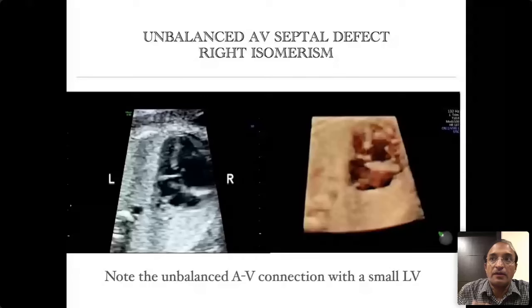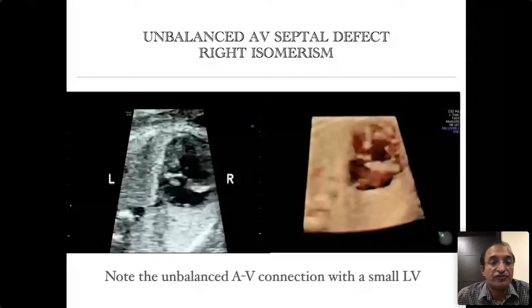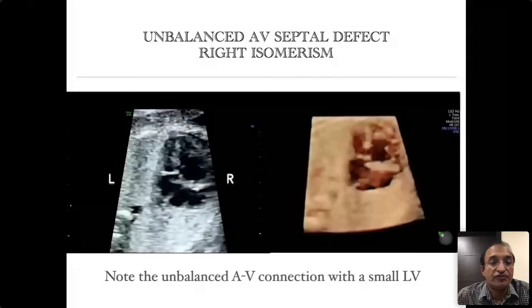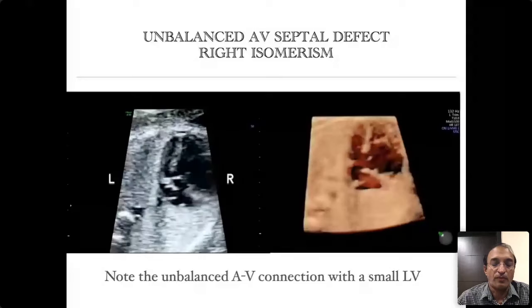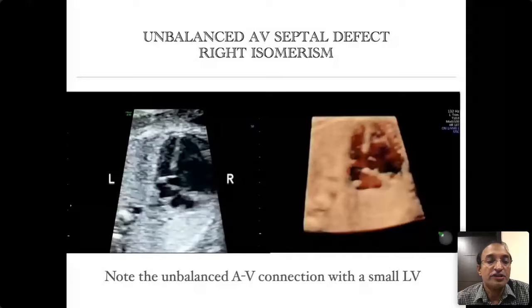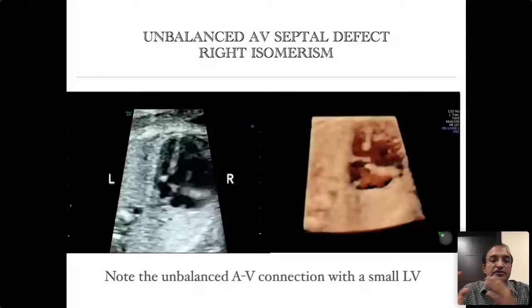Now look at this type of AV septal defect — the valve is predominantly opening into the right ventricle, which is the large ventricle, while the left-sided ventricle is really small. This should not be termed hypoplastic left heart syndrome; that would be wrong. This is correctly termed an unbalanced AV septal defect with a small LV.